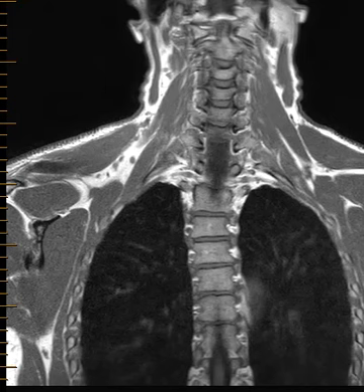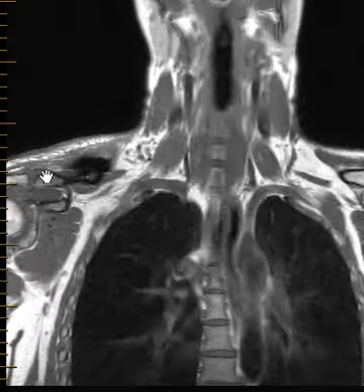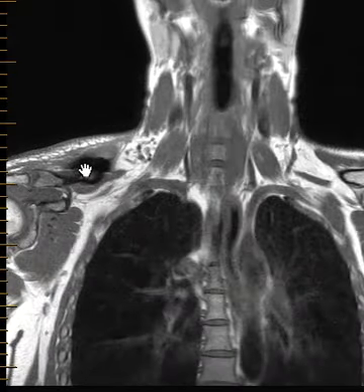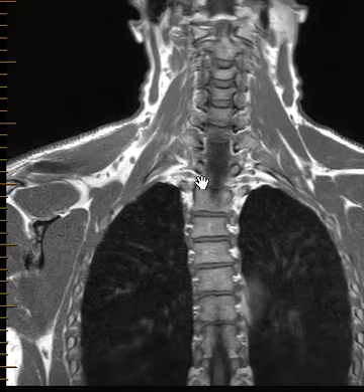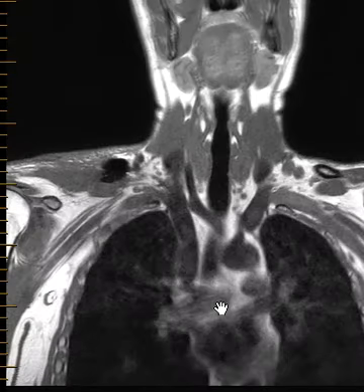Hello, this is Dr. Gay from First Lake MRI. This is a 34-year-old male with complaints of right-sided upper extremity neurologic complaints who had been thrown from a horse a month or so ago and fractured their clavicle, had subsequent internal orthopedic fixation. We can see over here on the right, this is the hardware going across the clavicle that's been fixed. This is the cervical spine up here, thoracic spine, and they wanted to do an MRI of the brachial plexus to evaluate their neurologic complaints.